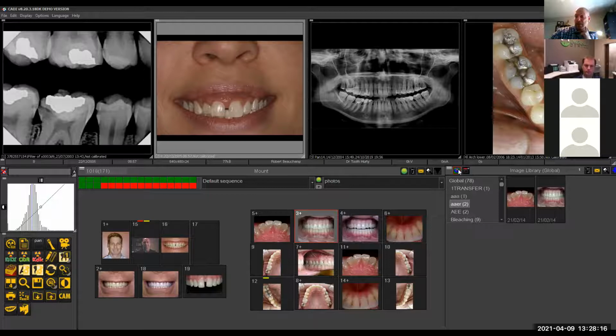I even had a really interesting doctor who was showing compromised treatments. So the guy did a large MOD, with a very thin cusp remaining, and told the patient, look, we might do this today, but you go and eat some popcorn next week and that sucker pops off, we're going to have to do a crown anyway. Let me show you this one picture of that situation. And he shows these cusp fractures, giving you both sides of the coin here. So yes, we could do this now. It might cost a little less now, but later you might end up doing this anyway. So my recommendation is we do it now the first time the right way, to avoid the additional costs.